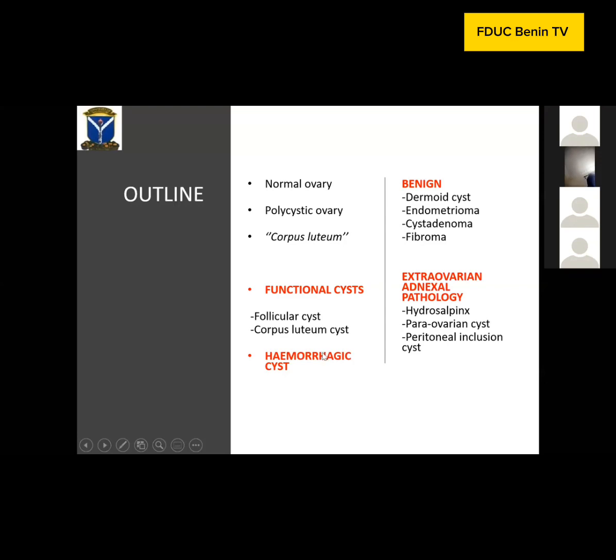Because what is complex? Any tissue or cyst that has any echogenicity within is considered as a complex mass. And there are many complex masses encountered in clinical practice. And unfortunately, a few will go under the knife of the surgeon because of the report of the complex cysts.